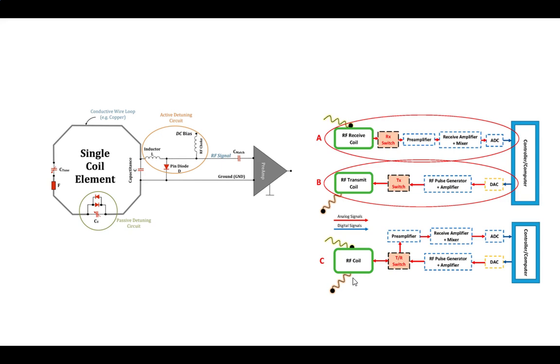So imagine if I'm looking at the phosphorus thing at night, it's pretty, and I go, oh, that's lovely, right? If I stare right at the sun, I've got a problem. So the fuse is there to prevent me from that problem. There are a couple other things in there, but I can use these C tunes. This one is kind of fixed to provide a baseline to get me in the general area, and then I can just adjust this one electronically, because we can have tunable capacitors for them, and that's what we do.